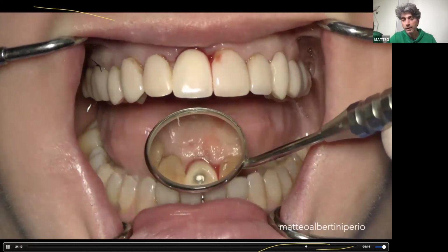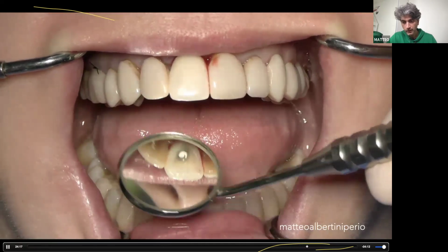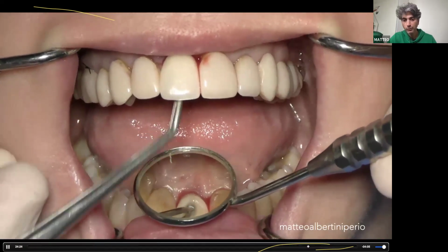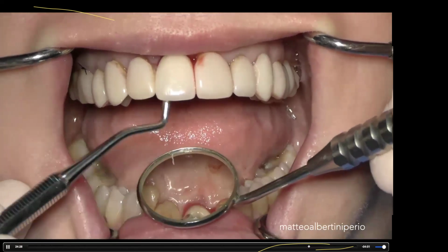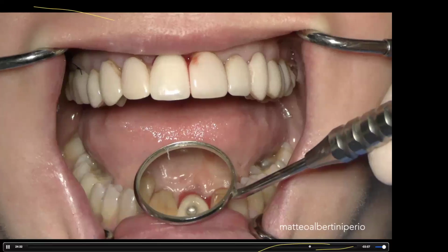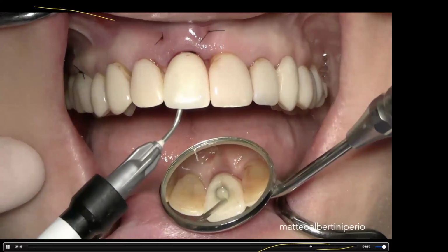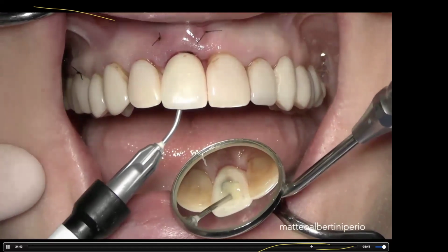Or whatever edentulous space you can do with guided surgery, but in these cases it's crucial to put the implant in a perfect position. Да, конечно, кейсы с полной адентией, это прекрасный пример, где можно хорошо использовать навигационную хирургию, но вот такие клинические случаи, где критически важно правильно установить имплантат во фронте, это, конечно, тоже одно из таких частых показаний.